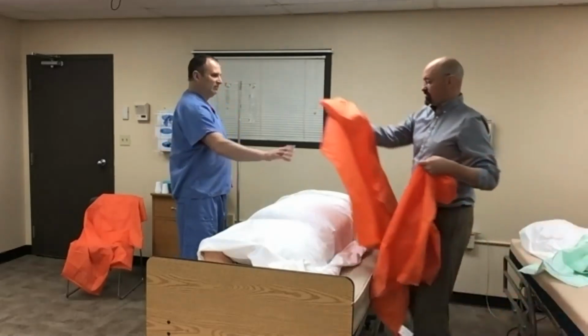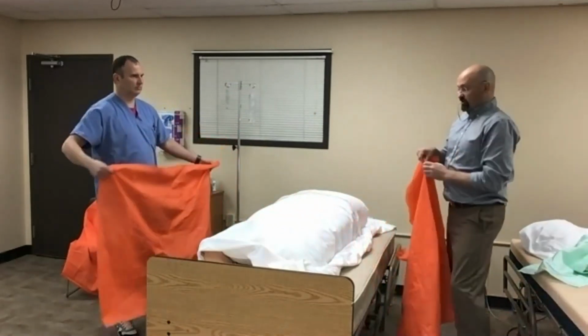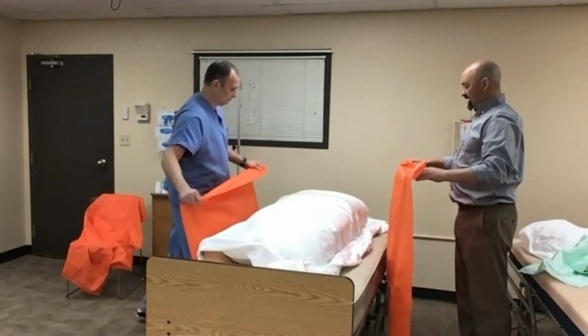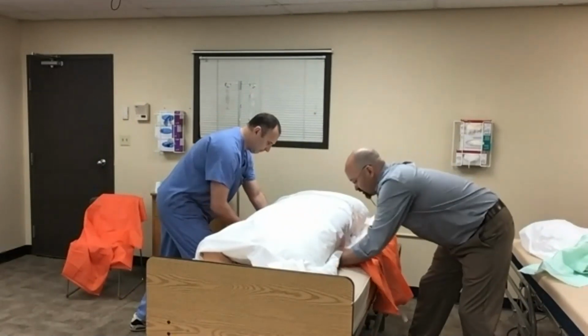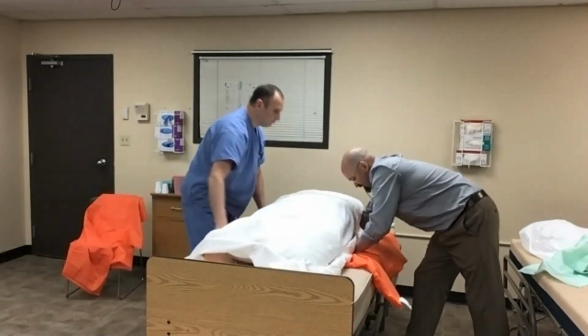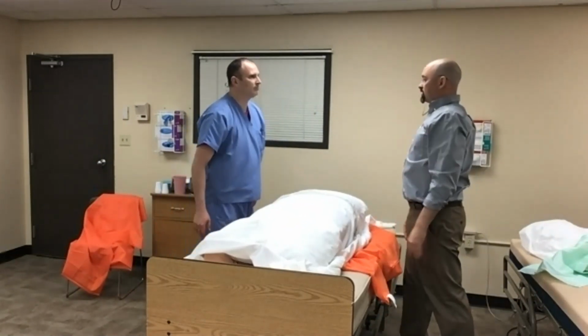So we're going to use slide sheets to do this task. The first way, these are tubular slide sheets. You're going to tuck it under so you have half on my side, half on his side. And we're going underneath the bottom sheet. You're going underneath the whole thing. And you're just going to tuck to make sure you're covering from the hip to the shoulder all the way across.